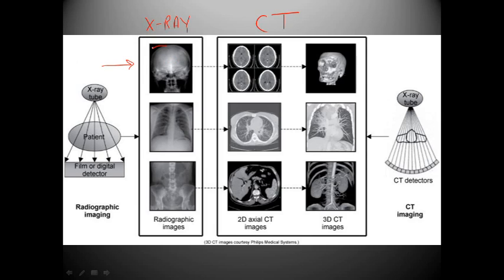And so you have all of the bony anatomy, and you might be able to rule out a fracture, things like that. But you cannot tell if there's actually trauma inside of the head. And so that's where CT does an excellent job. Notice we can see both the cranium and we can see what's inside the cranium here. And so that's very important.